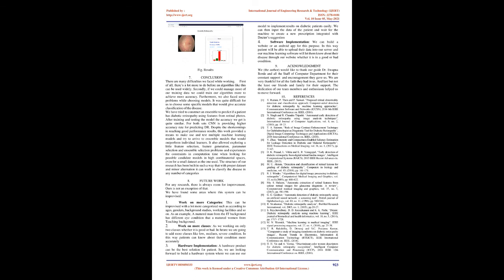4. Software implementation. We can build a website or an Android app for this purpose. In this way patient will be able to upload their data into our server and our machine learning software will let them know about their disease through our website, whether it is in a good or bad condition.